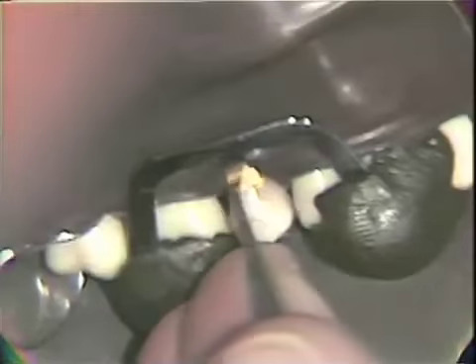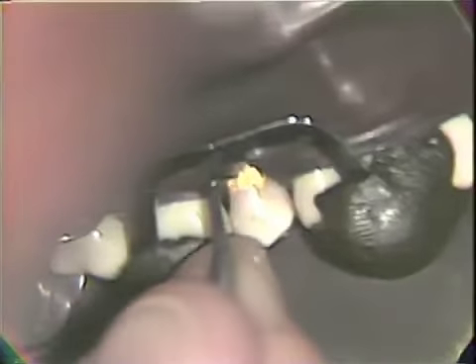You see, as we apply this piece of metal, the alloyed filling gold to the surface, there is the immediate coherence of the material. Care has to be exercised in condensing near the margins, of course, so that we don't have the condensing instrument lie directly on that enamel margin, obviously there would be a problem here, one of destroying the integrity of that enamel margin itself.